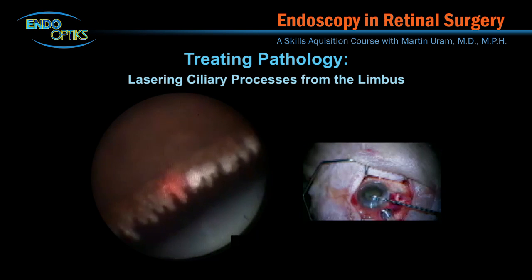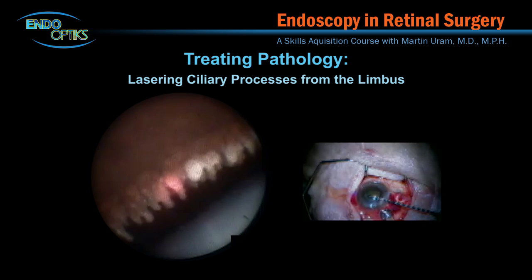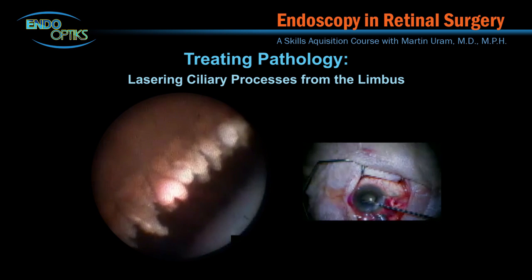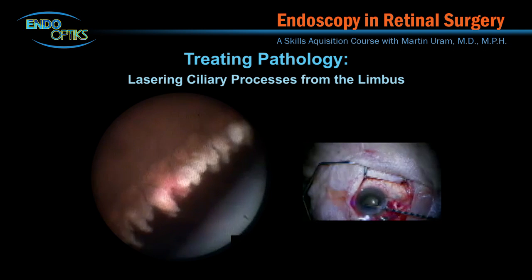This is a phakic eye with well-inflated sulcus undergoing ECP. The entire length of each ciliary process is visible, along with the fine zonules and their attachments to the lens capsule. The aiming beam of the laser is placed on the processes and they are painted white.